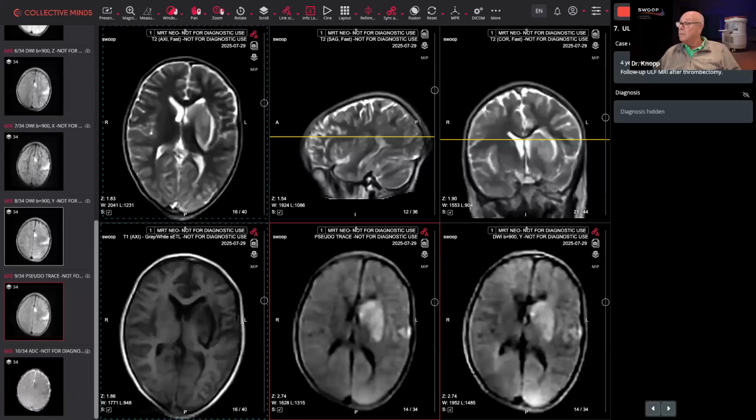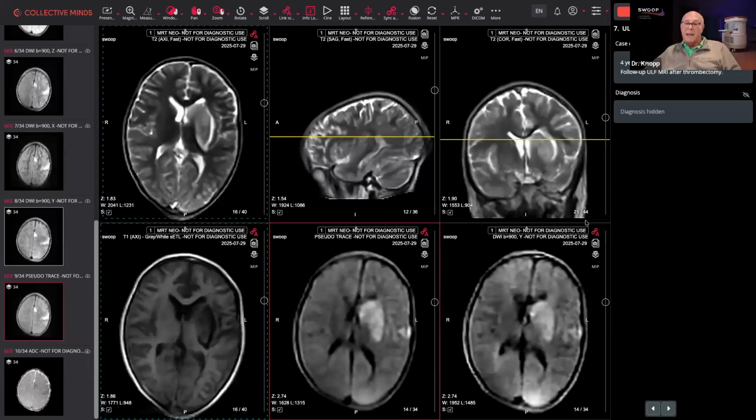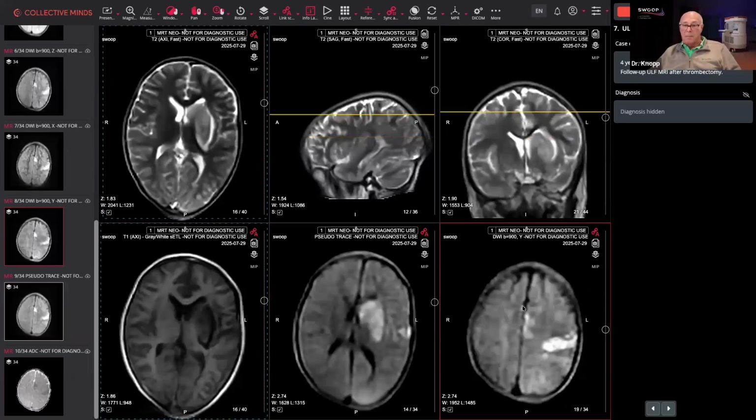And then the one question that I would also always ask you, of course, as a neuroradiologist, and especially in this case, as the last case probably still had an open fontanelle, and I wouldn't be so much alerted about intracranial pressure. But here, are there any signs of intracranial pressure? And again, could you probably say what would I see?